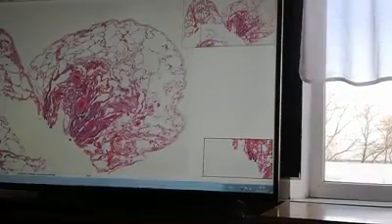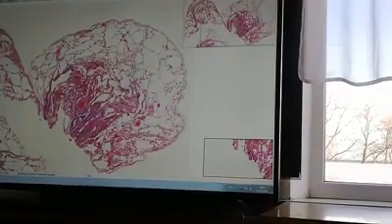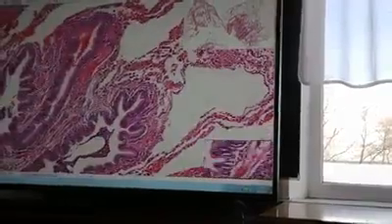And one more preparation. It's pulmonary emphysema, emphysema of the lungs. You know, emphysema is a variant of compensatory hypertrophy. At first, it has benign significance. It's important to compensate for decreased function of the lungs, but in the later period, it will lead to pathological changes when the decompensation stage comes. What we can see here, of course, is lung tissue, hematoxylin and eosin. We can see some bronchi, and we can see that the bronchi come with normal columnar epithelium lining.